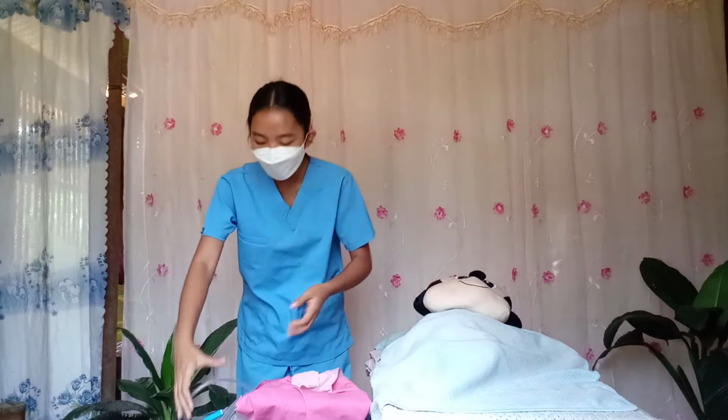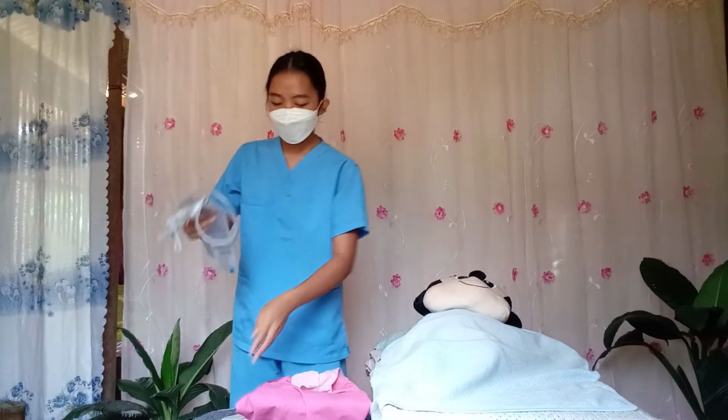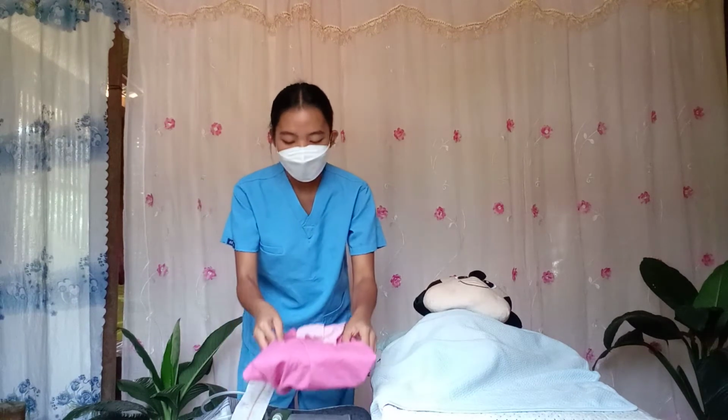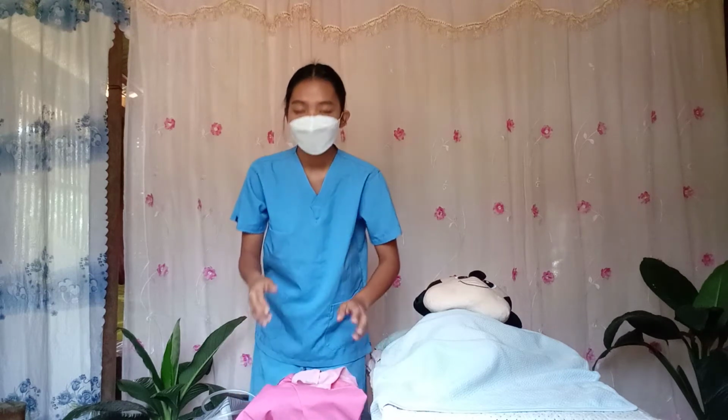Prior to the conduct of this procedure, I already checked the doctor's order to know that I have the right patient and the right procedure to be done. I also already performed hand washing, to lessen the spread of microorganisms and contamination. I also secured all the necessary equipment that I'll be using: the urinary bag, the two-way Foley catheter, and my catheterization set. Without further ado, let's get started.